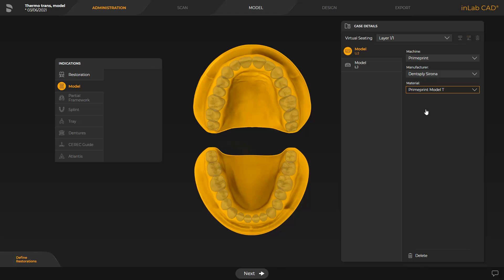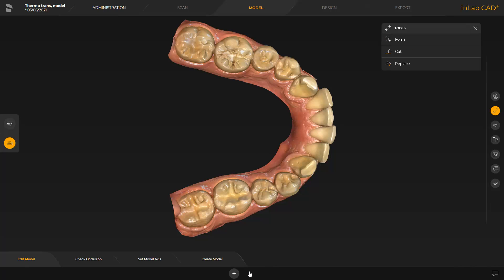The scan phase is grayed out since these are intraoral scan data. Now we are inside the Edit model step and with the different tools, we could edit the model data if desired. Next, we go to the Set model axis step.